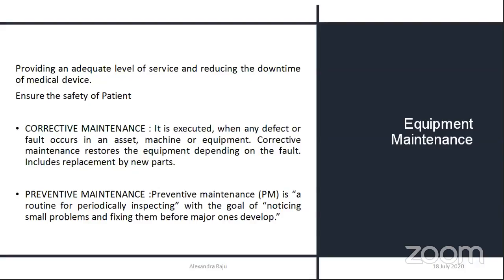So preventive maintenance is a routine or periodical inspection of a medical device, either done in a month or in 6 months' time, to reduce the downtime of a medical device and to ensure the patient safety. So now let's move on to the corrective maintenance, the troubleshooting of medical devices. Next slide, sir.